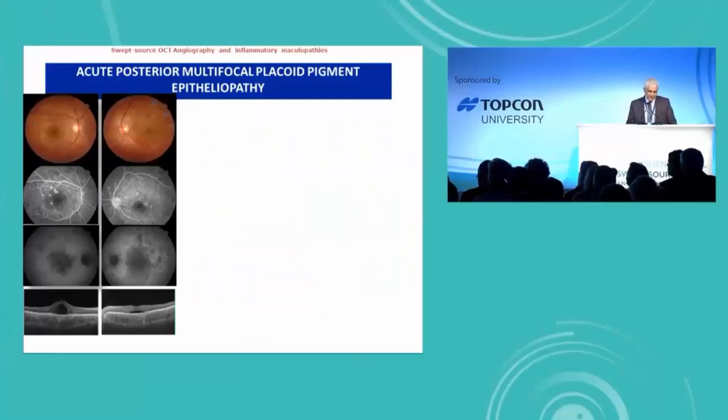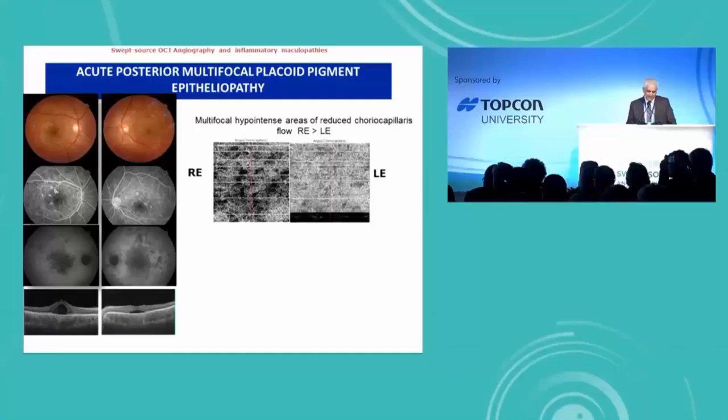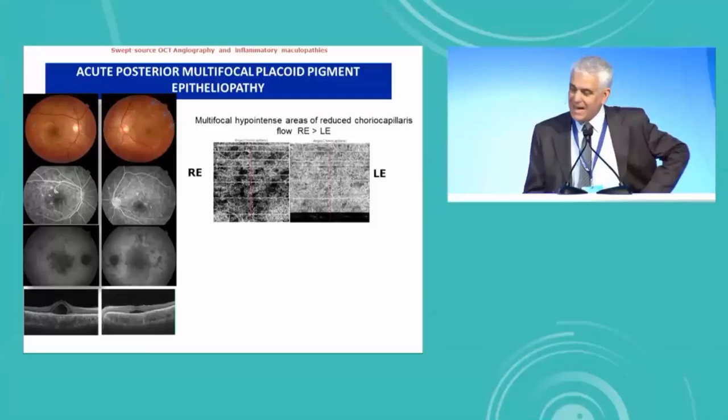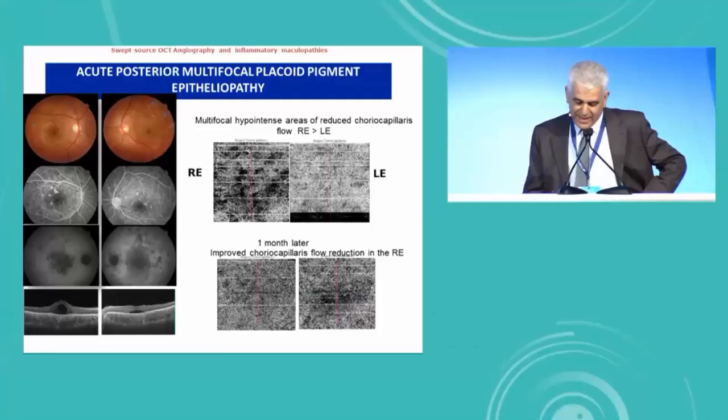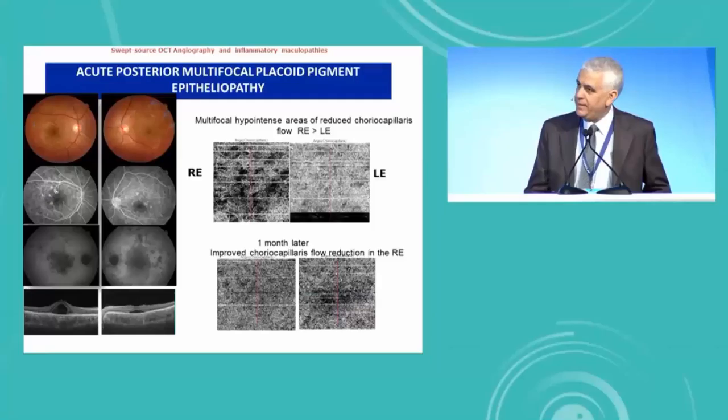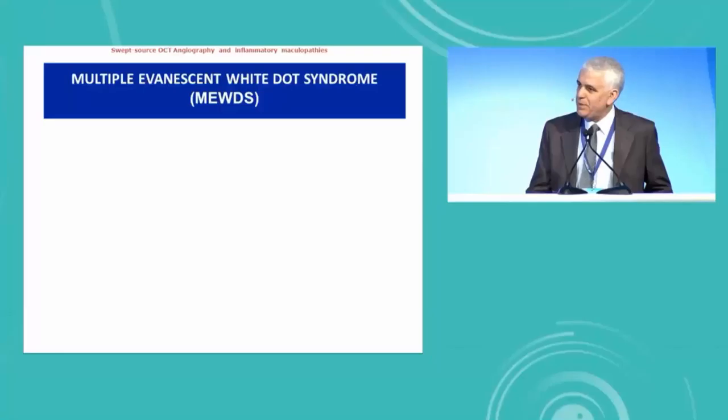The second case is a case of APMPPE. You can see multifocal hypointense areas of reduced choriocapillaries flow mainly in the right eye. One month later, you can see the improved choriocapillaries flow reduction in the right eye.